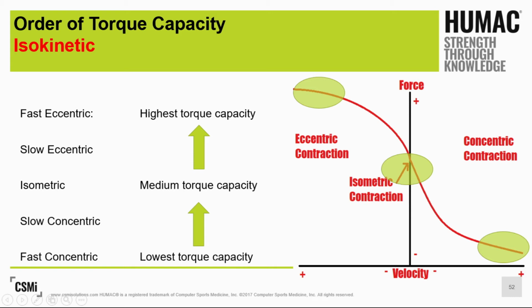So we can start our patients off isometrically at the beginning and then start with slow eccentric loading, working the speeds faster as they progress.